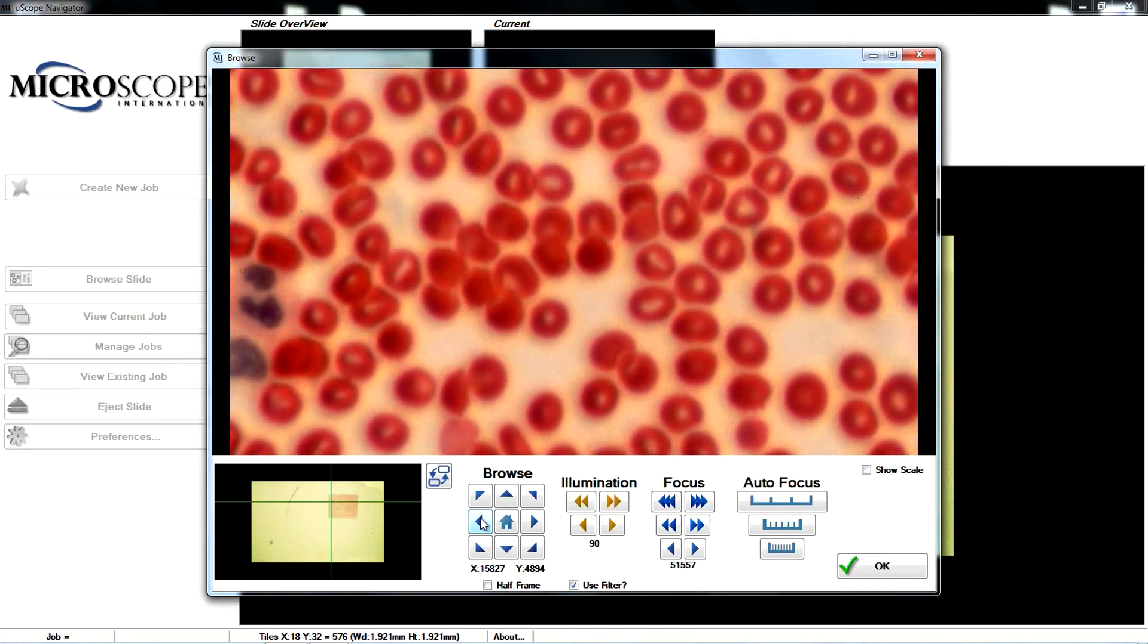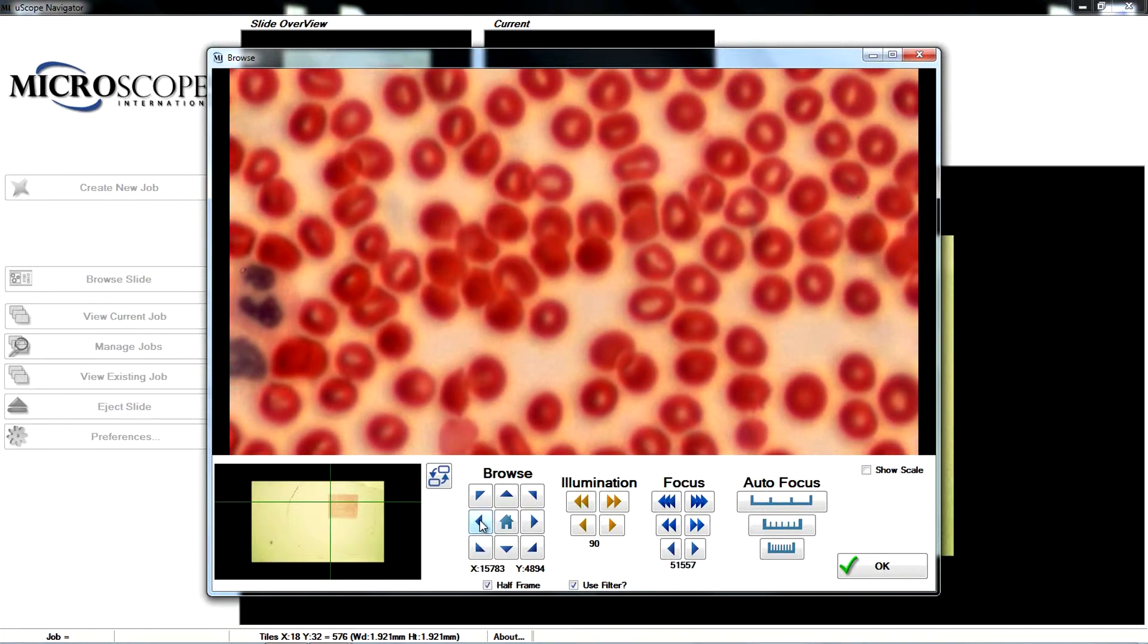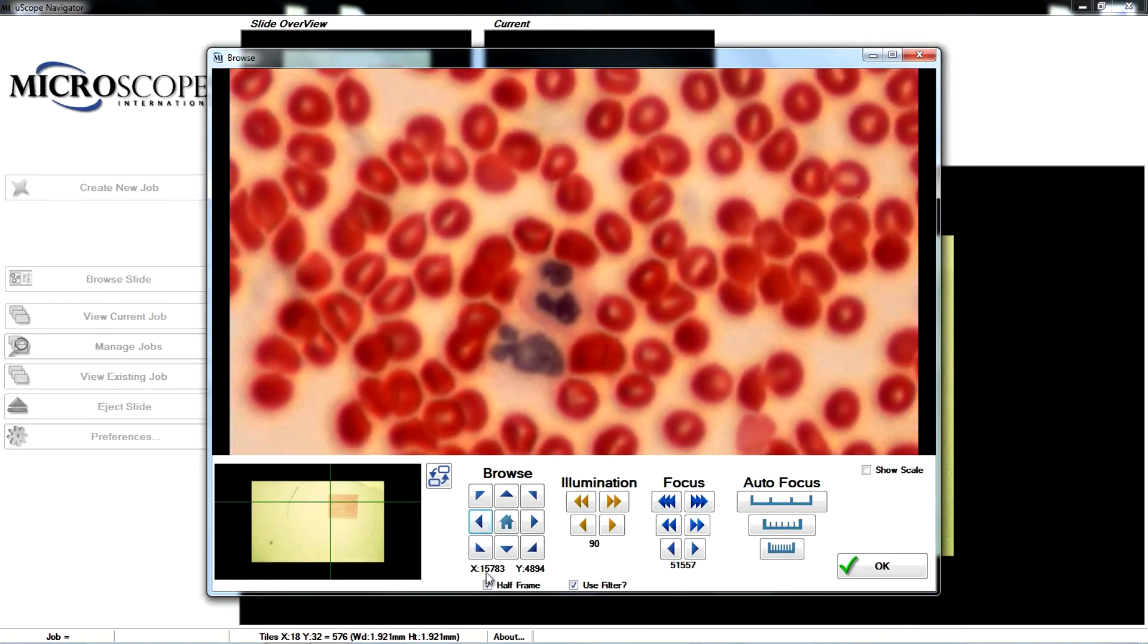By default, the browse controls move one whole image frame at a time. Use the half-frame checkbox to move by half-frame increments.